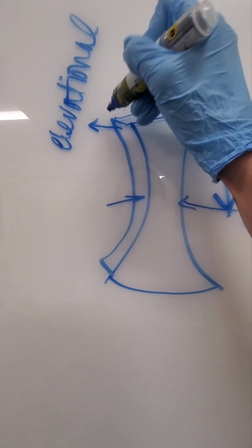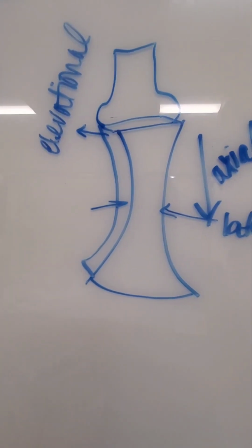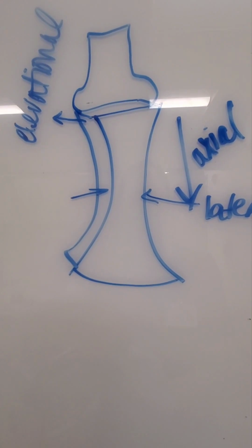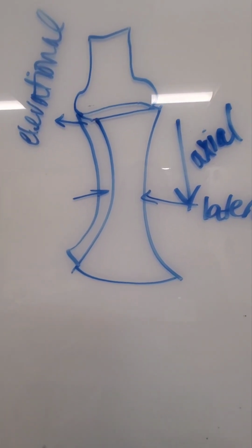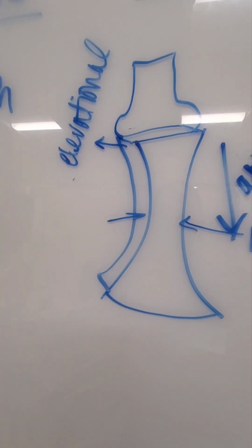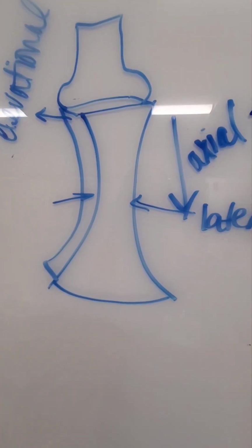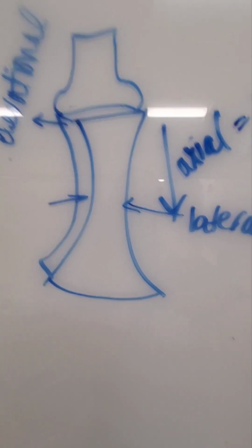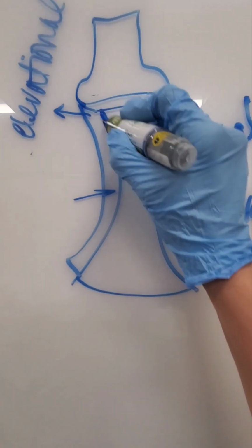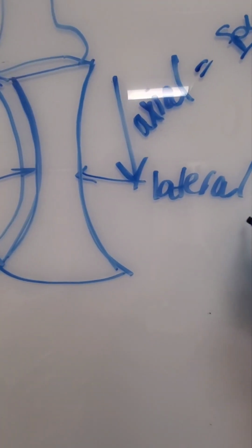Right, so my transducer's here. This sound beam has 3 dimensions. So elevational is one that's kind of built in, right? Axial is that SPL divided by 2. Lateral is how narrow we get that sound beam, or our focal zone.